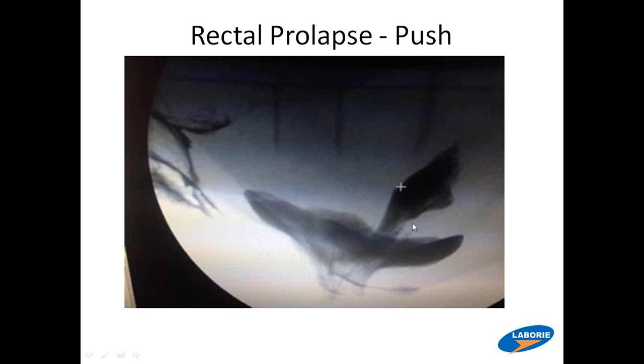And here you have this characteristic funnel. Kind of looks like a little tornado up here, and a mushroom upside down here. And I can tell you what's happening because you can see it dynamically occurring. This is the contents of the rectal wall, so the rectal wall isn't visible, but it's here, that are pushing down into the lower rectum. And indeed, I checked her. I said, oh my goodness, something's happening, and I was able to see on examination that with the progressive straining, she was prolapsing outside her anus.